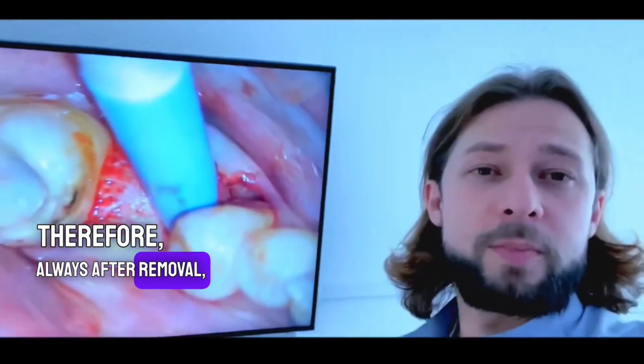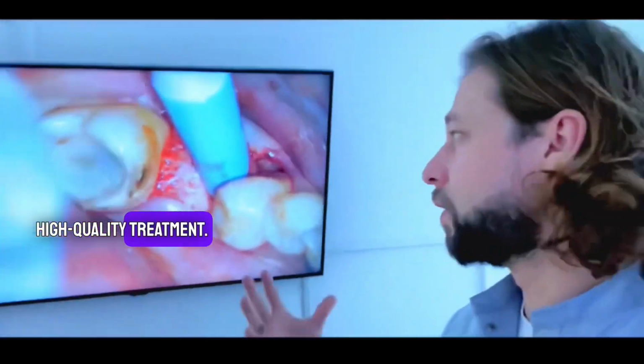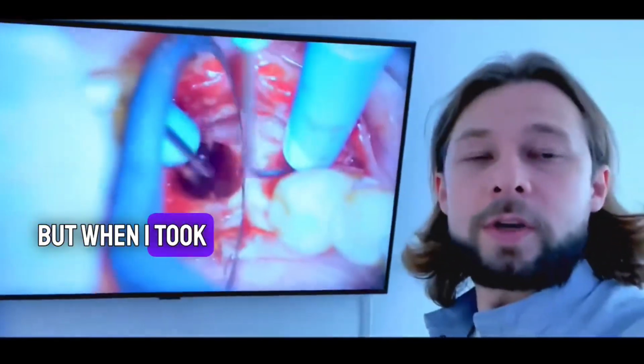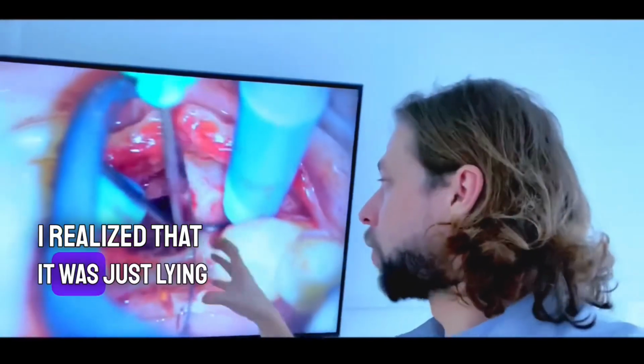Therefore, always after removal, do a good, high-quality treatment. Do not leave anything superfluous there. Although the volume is great, everything is fine. But when I took a picture with the implant, I realized that it was just lying in the depth.